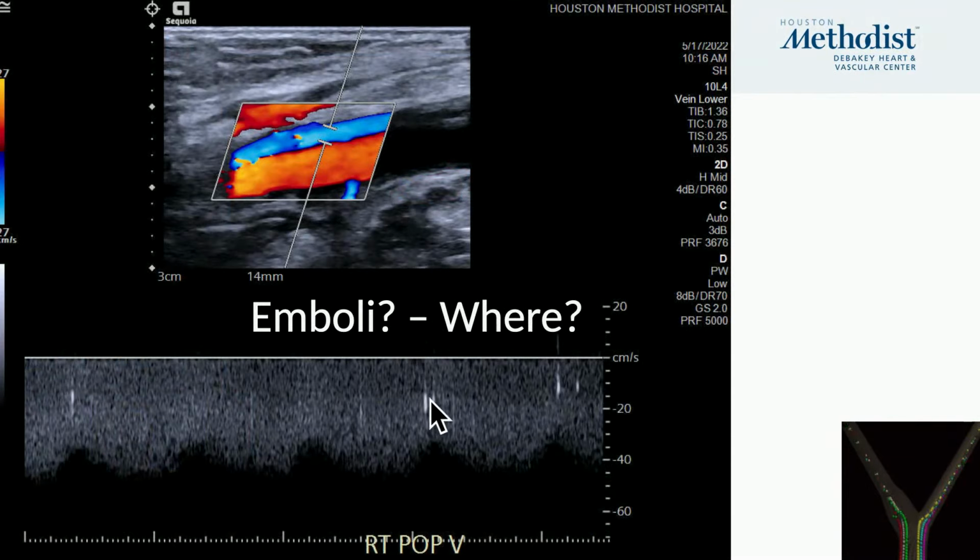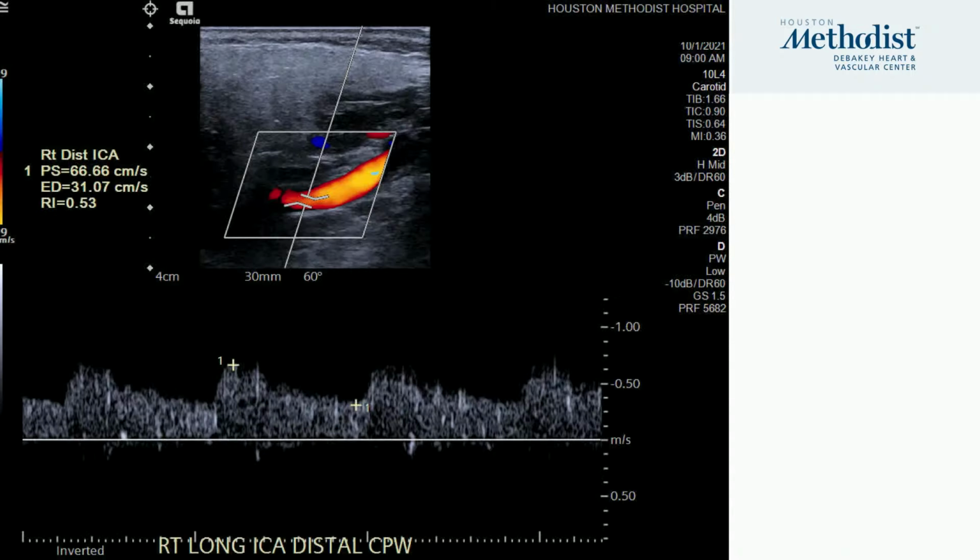You can see what the speed is. So the speed is about 20 centimeter per second. Here is a slower one. Maybe this is only traveling 10. Hard to make assumptions. We wish we could size them. We think that this is the heavy piece, maybe a little bit bigger piece. The pieces traveling faster are maybe lighter. But again, not much confirmation we can see about them.